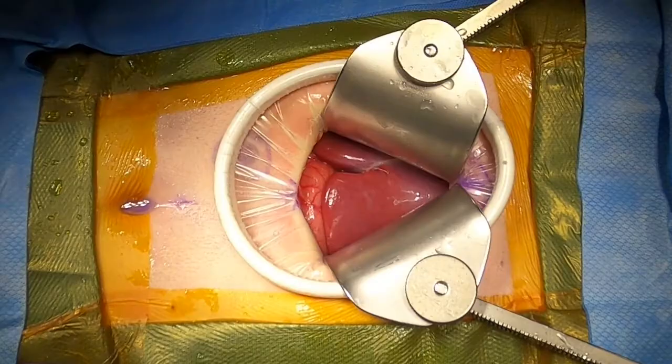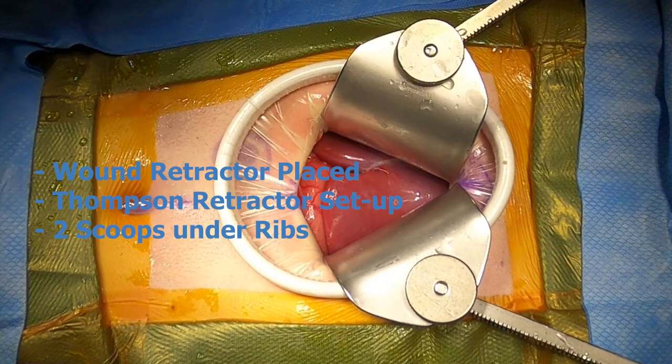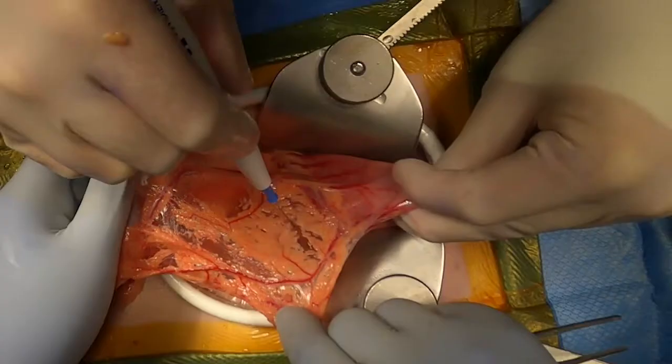The operation is initiated with a midline incision made from xiphoid to above the umbilicus. A wound retractor is placed and the Thompson is set up. Scoops are placed under the ribs to retract superlaterally on the right and left sides.